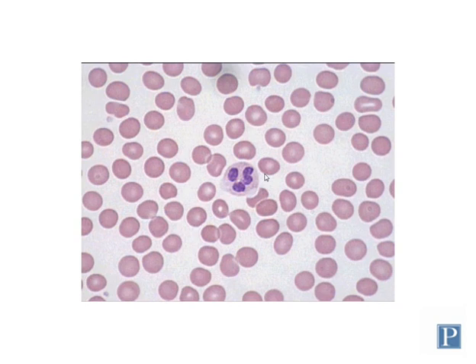We're going to now talk about blood cells for a little bit, so you'll spend some time in lab looking at blood smears, trying to identify different cell types that can commonly be found in blood smears. Recall that blood smears are typically stained with Wright stain, which is similar to H&E, but it allows you to identify white blood cells more easily. Most of the cells in a blood smear are red blood cells or erythrocytes, which are these disc-shaped cells here.